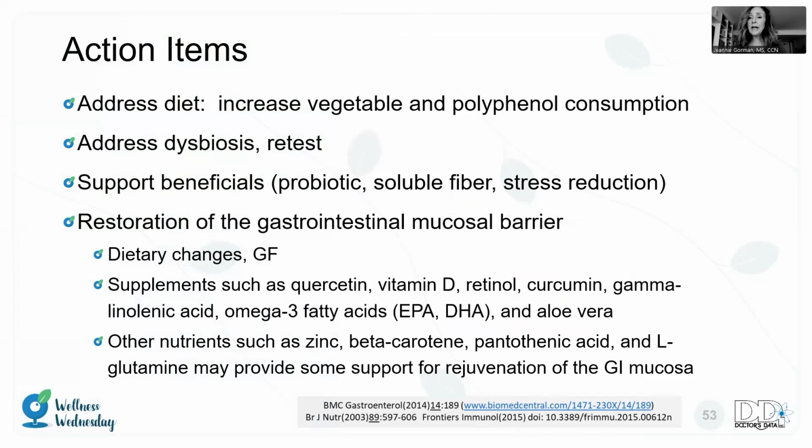The retesting on this patient would be to go back and reculture after treatment, 2 weeks away from treatment, 2 weeks off of probiotic if you started that. Go back and retest using our microbiology profile is an option for retesting in this patient. We have many profiles to choose from. You can separately do bacteriology. You can separately do yeast.